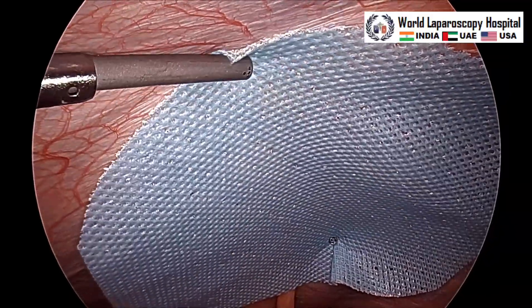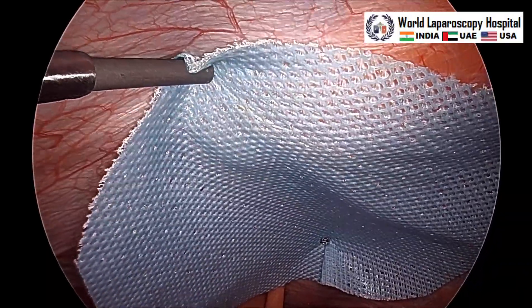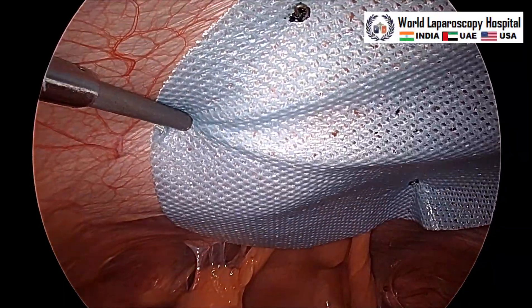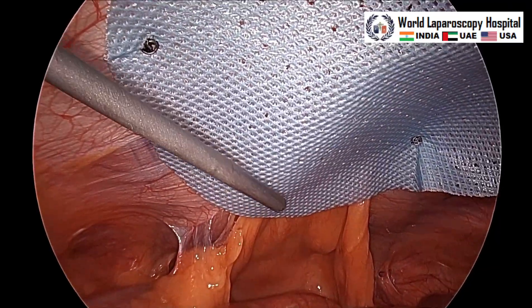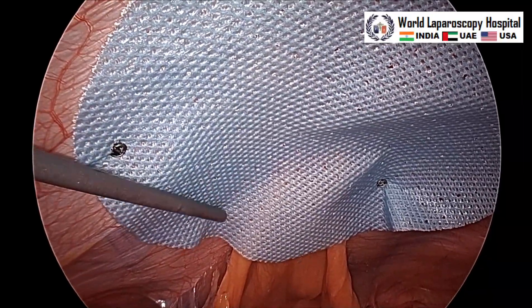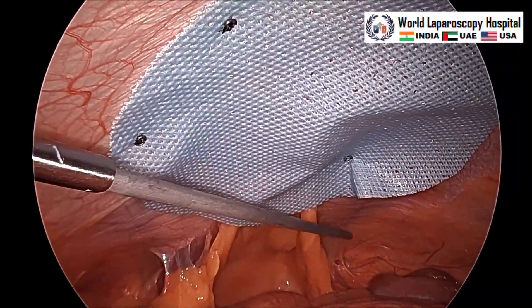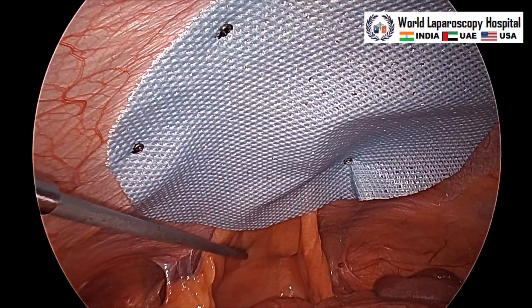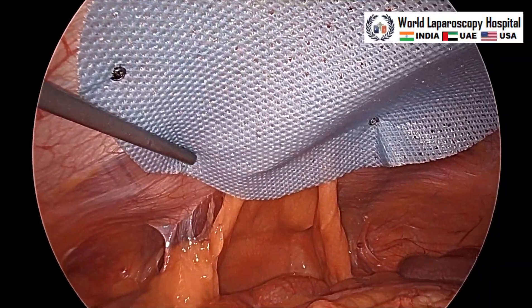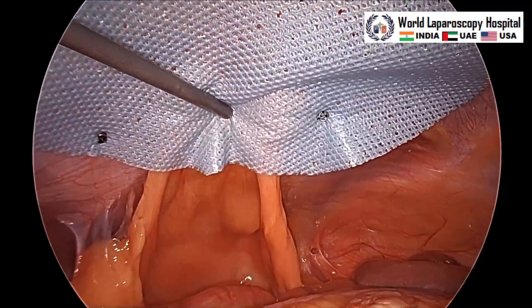The left hand finger will be pressed on the marking so that the abdominal wall will be perpendicular to the tacker and it will not go unilaterally — one side more or other side less. For the outer crowning, we have to be careful about the inferior epigastric vessels. You can see here, just lateral to the mesh, the inferior epigastric is coming here — this is the inferior epigastric vessel on both sides. These two are the medial umbilical ligaments. We are firing in between the inferior epigastric and medial umbilical ligament.